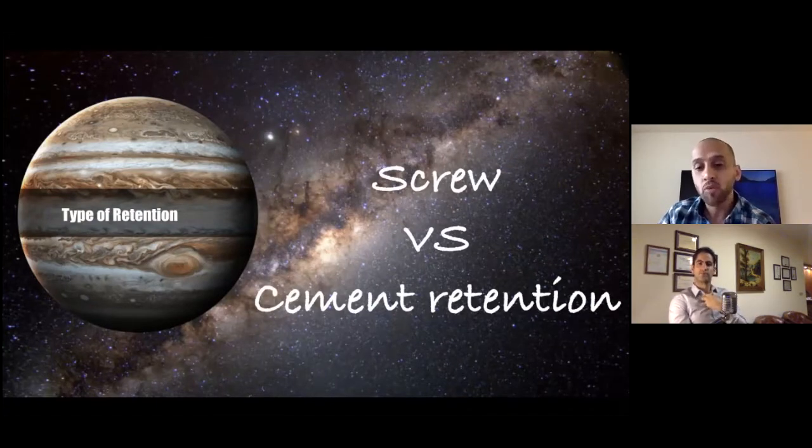But at no point am I going to say that we should be very radical in our decision-making. I'm not saying that you must do screw retention and cement retention is not right. That is not correct. Cement retention is a very viable treatment. Sometimes it is absolutely needed.